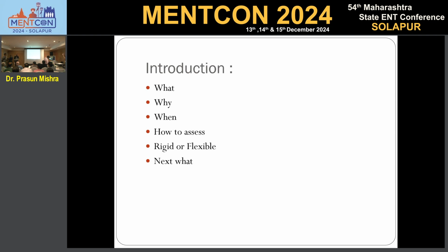or not. So our role as a laryngologist or as a specialized ENT surgeon is to find out more. It is an investigation we have, it's a machine we have spent so much money on. So let us make maximum use of this machine and try to diagnose most of the pathologies. I don't think anything can be missed out if you do a proper thorough stroboscopy. It is just that you need to have a good instrument.